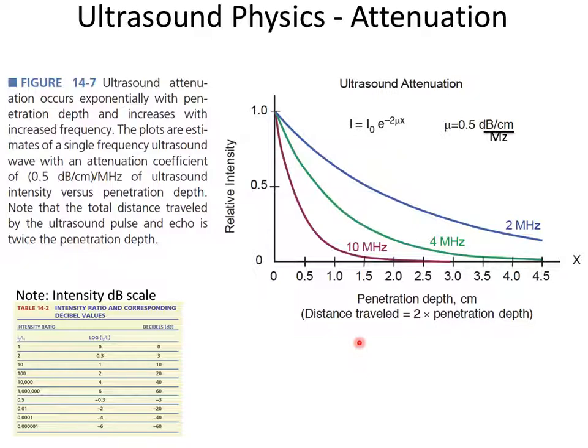And so therapeutic ultrasound is when you put the ultrasound transducer on something and you focus all of the ultrasound to a point and you heat the tissue, right?